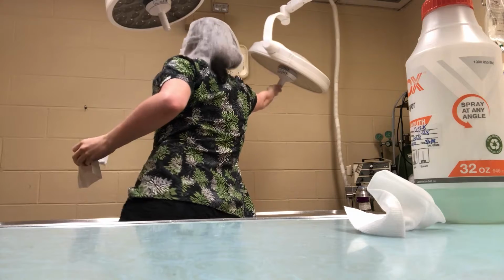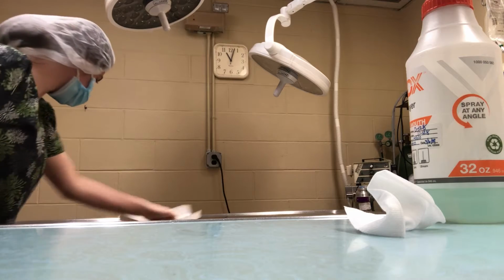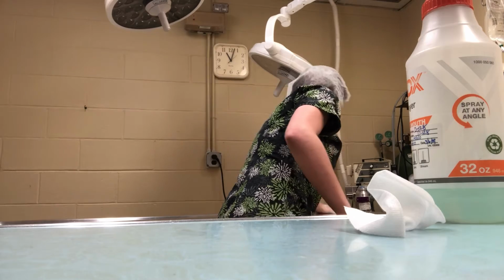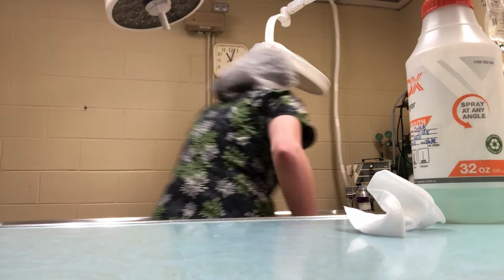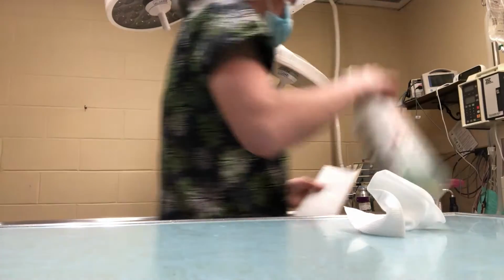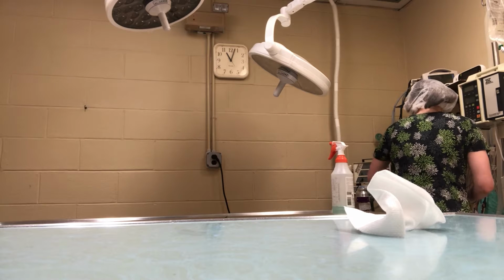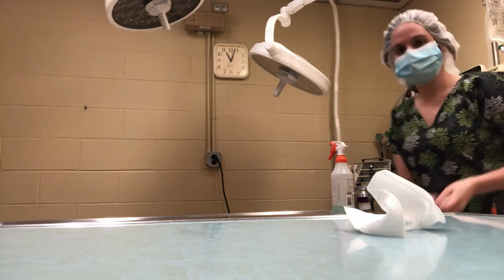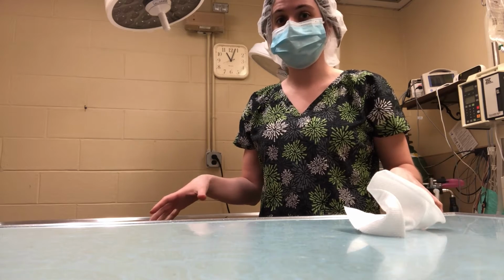Back up. And then wipe our table down. And then to minimize dust particles building up, we also want to go ahead and wipe down all of our machinery over here. And now the room is clean and it's ready if we need another surgery in here to get set up for that surgery.